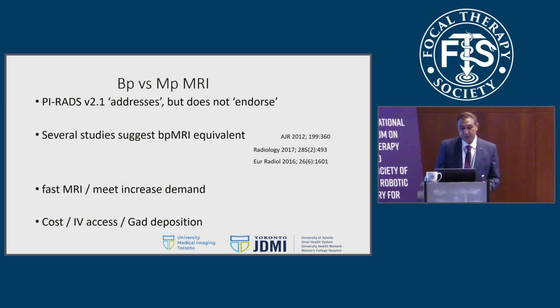It may be the only way to meet the increased demand of prostate MRI, and there are other advantages like cost, IV access, and gadolinium deposition can be avoided.